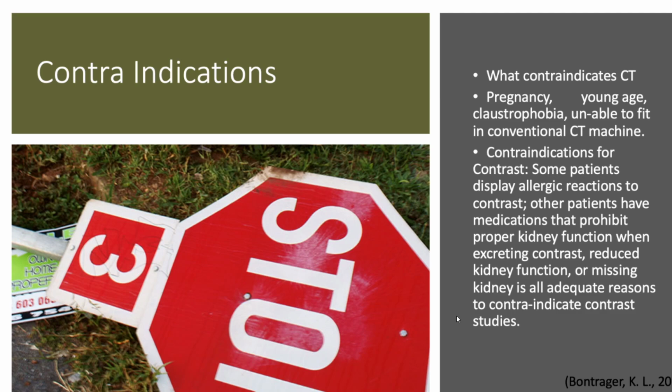Moving forward, we have contraindications for CT. If you're pregnant, the dose of a CT scan is significant enough that it'd be a risk to the child, so it would be advised against giving a mother a CT in early pregnancy unless it's absolutely necessary. Young age, again, a young patient is very susceptible to radiation. We don't want to expose infants or anybody who's very susceptible to radiation damage. Maybe people who are claustrophobic, who don't feel safe inside the machine, or it's too loud, and they physically just can't handle the idea of being inside a CT machine.